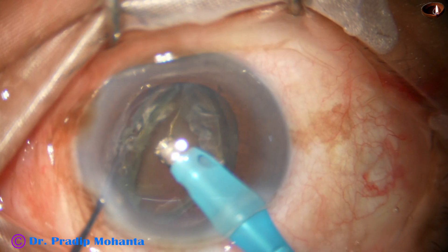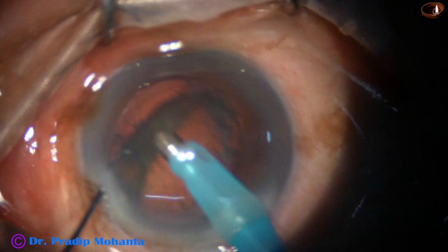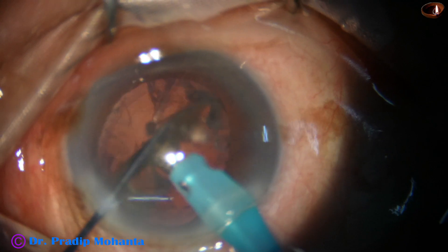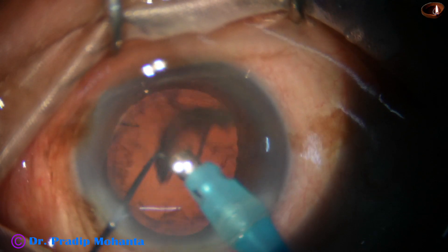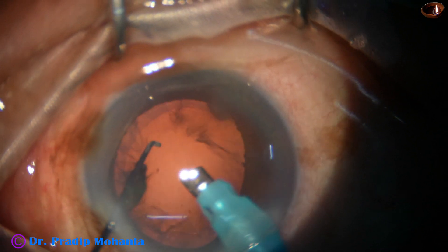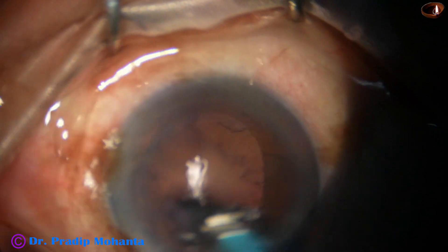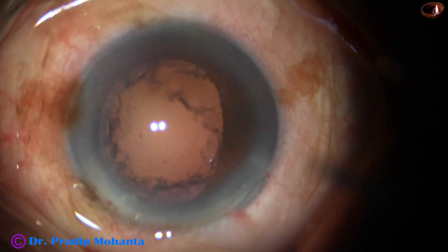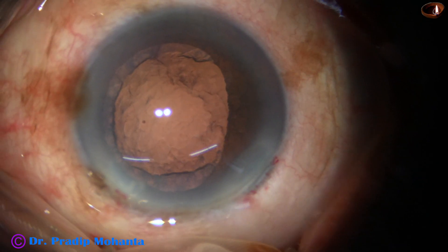This is the epinucleus shell remaining now and the nucleus has been removed. Now I use the stereo coaxial illumination — we get more depth perception. We can make out at which level the phaco tip is, and using a little lower vacuum, removing the epinucleus shell. Thus we could manage this case quite well.